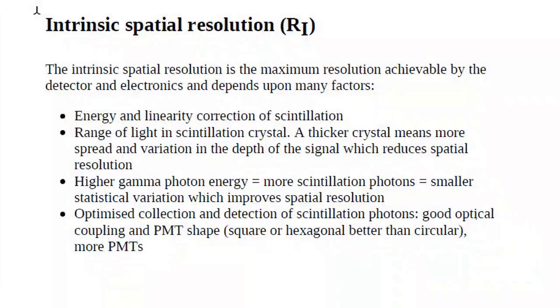So when I say I want to calculate the resolution of the system, I calculate the resolution of the intrinsic plus the resolution of the extrinsic, which is the collimator for the crystal. We talked about the crystal itself, and we said last time that if its thickness increases, sensitivity increases, but resolution decreases. If the thickness is low, then sensitivity decreases, but resolution increases.